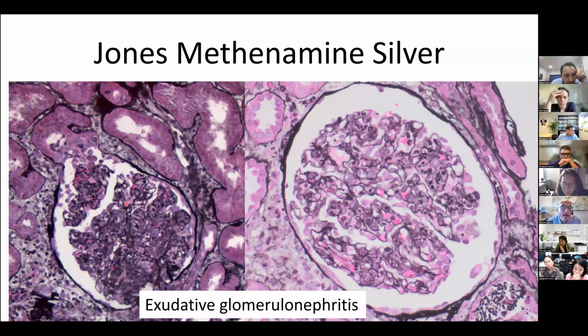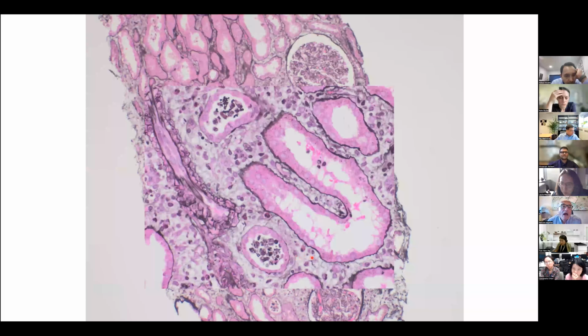And some other glomeruli had very prominent glomerulonephritis in terms of increased lobulation of the capillary tuft. But the tubulointerstitium was not quite intact either. Some of the tubules were showing acute tubular injury, and there are different morphologic features of acute tubular injury, but a common feature is that instead of seeing the thick brush borders on the apical aspect of these epithelial cells, we see flattening.